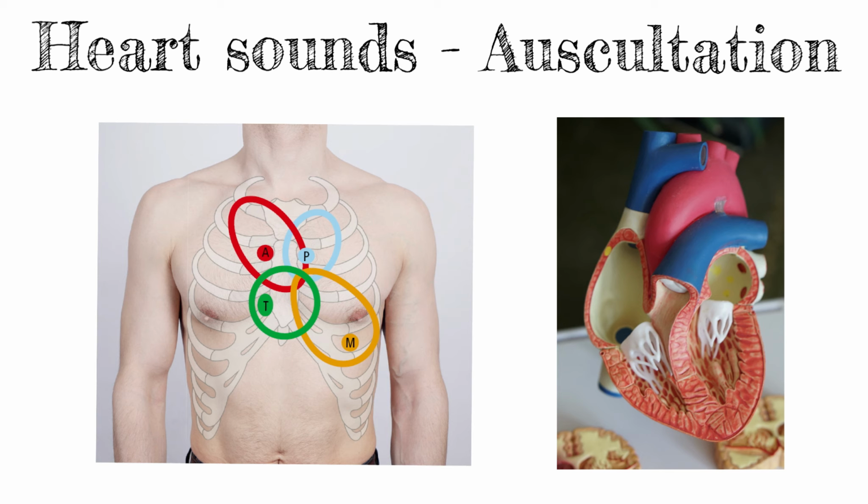But the literature does mention that when you apply the bell to the mitral valve, you mustn't be very forceful. You should actually put it very lightly over the chest, because if you push too hard, you're actually making the bell a diaphragm. So very important technique-wise when you're using the bell to push lightly.